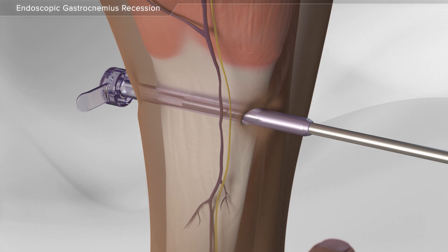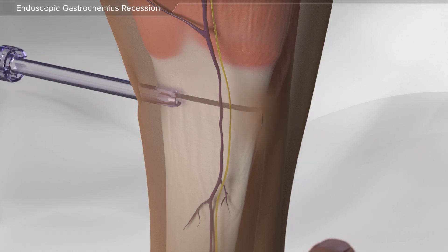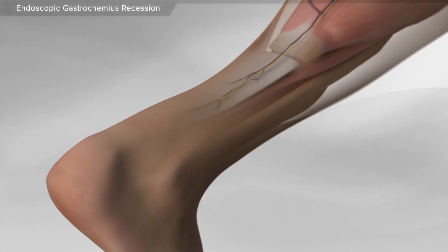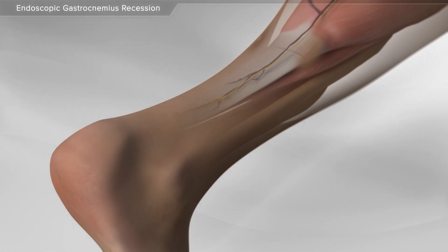After completing the release of the calf muscle, the instruments are removed. Lastly, your surgeon will move the ankle to demonstrate restoration of normal ankle motion. This completes the endoscopic gastrocnemius recession procedure.